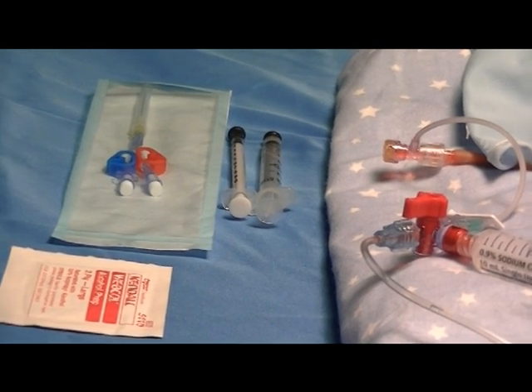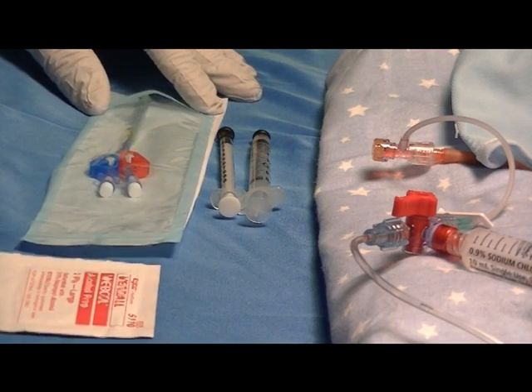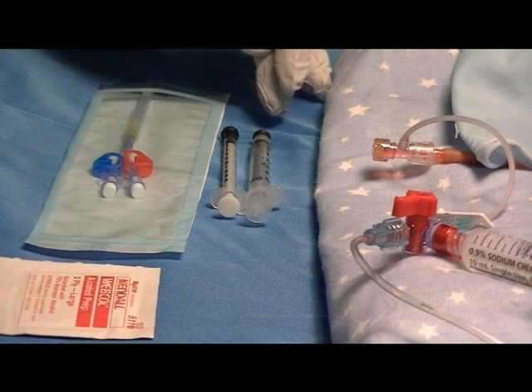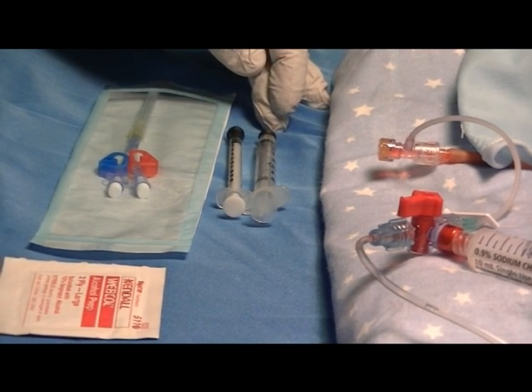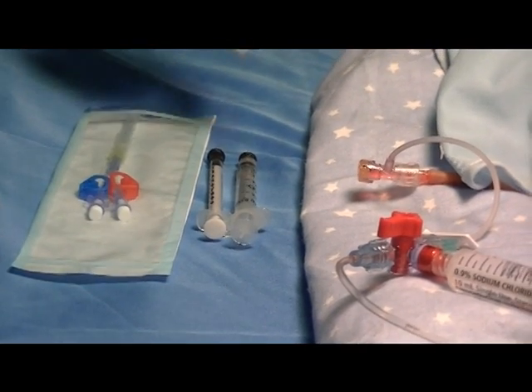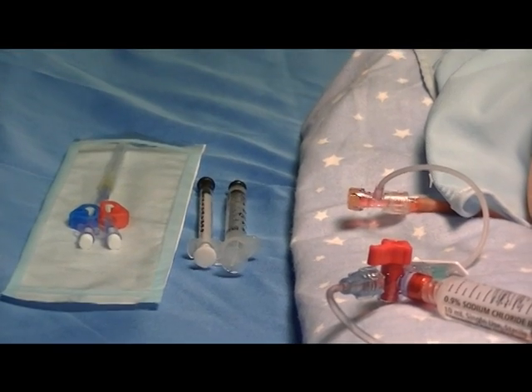The first thing you need to do is gather the appropriate materials: the Humi Microdraw device itself, a 1ml blood gas aspirating syringe, a 3ml aspirating syringe, and the appropriate prep material to prep the split septum T connector that will be attached to the umbilical catheter.